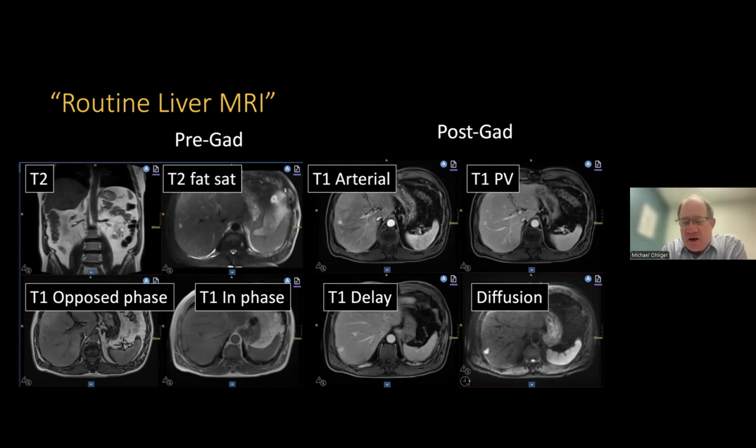And then the second thing we can talk about is what's the difference between a CT pancreas, abdomen CT, and an MRCP when looking at the pancreatic duct. And like I said, I think we have plenty of time for this overall talk, so happy to chat about any topics.